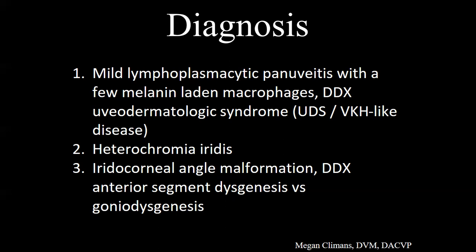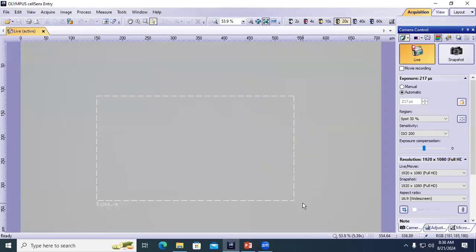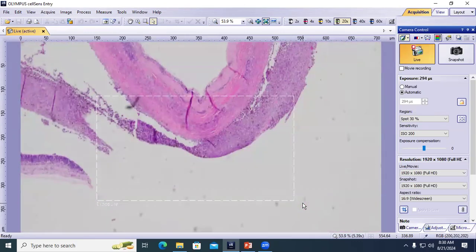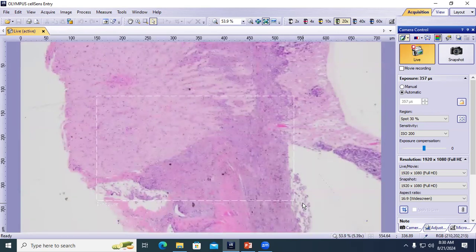And then Billy also asked, was there any meningitis near the optic nerve? Not necessarily in your case, right? Yeah, no, not really. We see that inflammation around the optic nerve, and I usually interpret that as a continuation of the choroiditis in the pigmented portion of the choroid that extends around the optic nerve head, without a lot of involvement of the meninges or optic nerve.